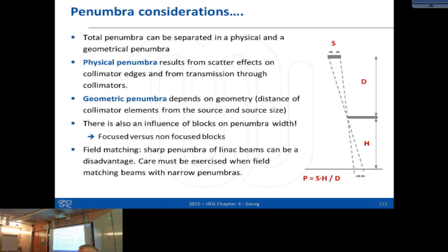The Austrian way. Because let's write an email to react, yeah? And then you need to think about that also, to perform training with all the personnel, because you don't know who is there. I mean, the RTTs should be there, but also physicists. You need somebody to go in, to get at least the patient off. If there is a patient in the mask system, you need to free him or her and get them out, even if you don't want to put the source back.